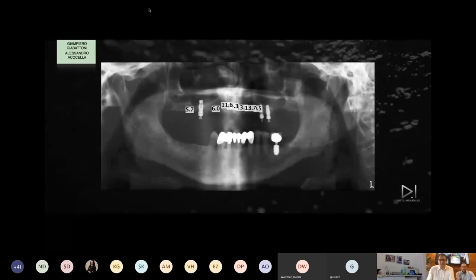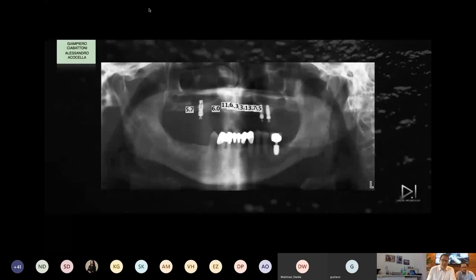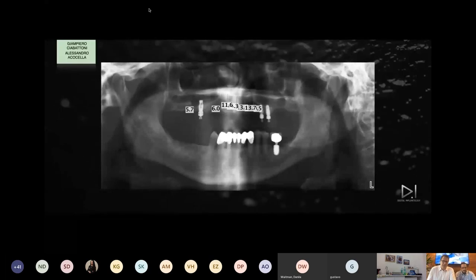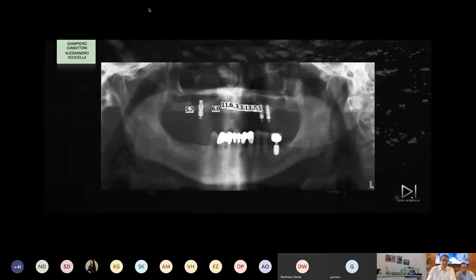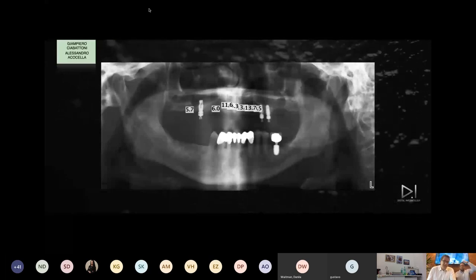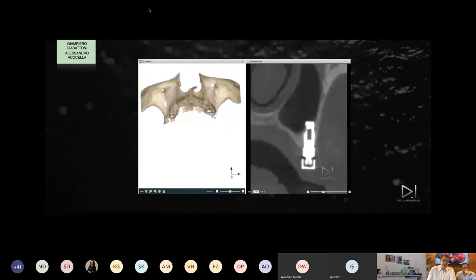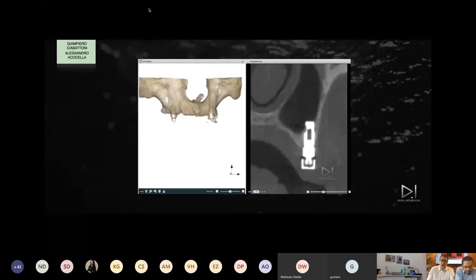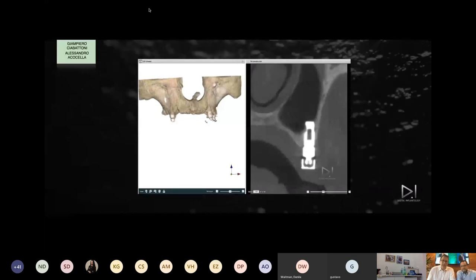It's very common to find patients with some implants. These implants are from two different companies. And we decided to use a new technology simply to match the CT scan with the intraoral scan or the lab scan, to have direct stabilization with a tripod, like in this case, of our guide. And we have a CT scan, and we try to match our scan with the implant. It's not so easy, but it's possible to do, like with teeth.